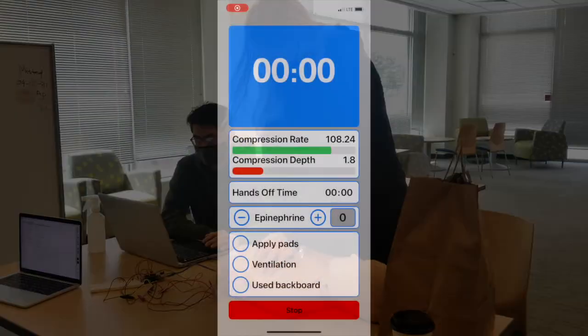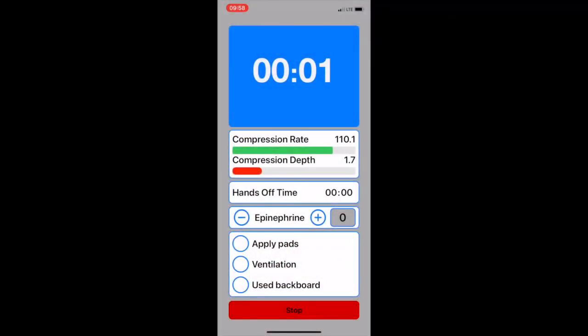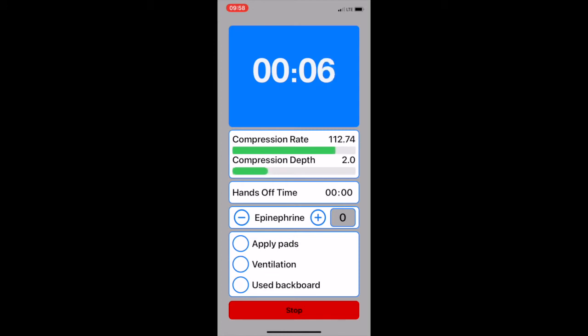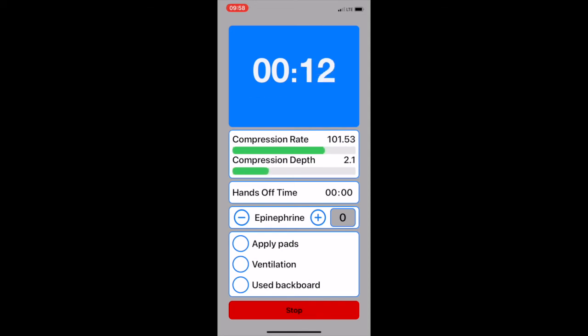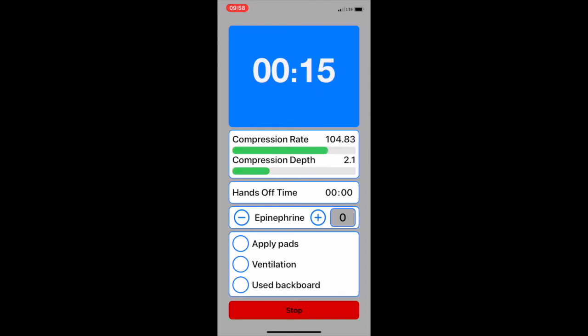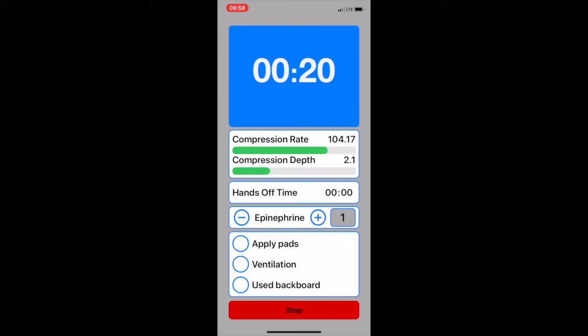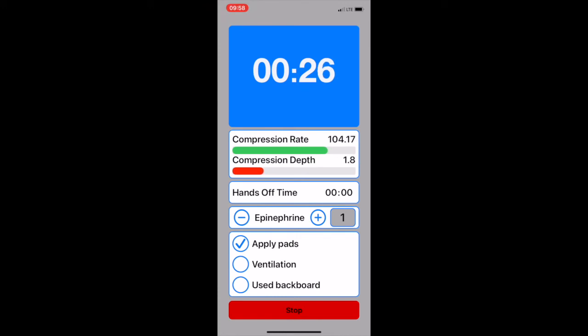As you can see, the app is receiving data from the sensor and converting it to human-readable values. When those values fall outside of the desired range, such as when the compression rate is too slow, the bar is turned from green to red, and a warning message is displayed underneath the time on the blue window on the top of the app. Also, there are buttons that allow for the tracking of events that the sensor cannot detect, such as the administration of epinephrine or when AED pads are applied.